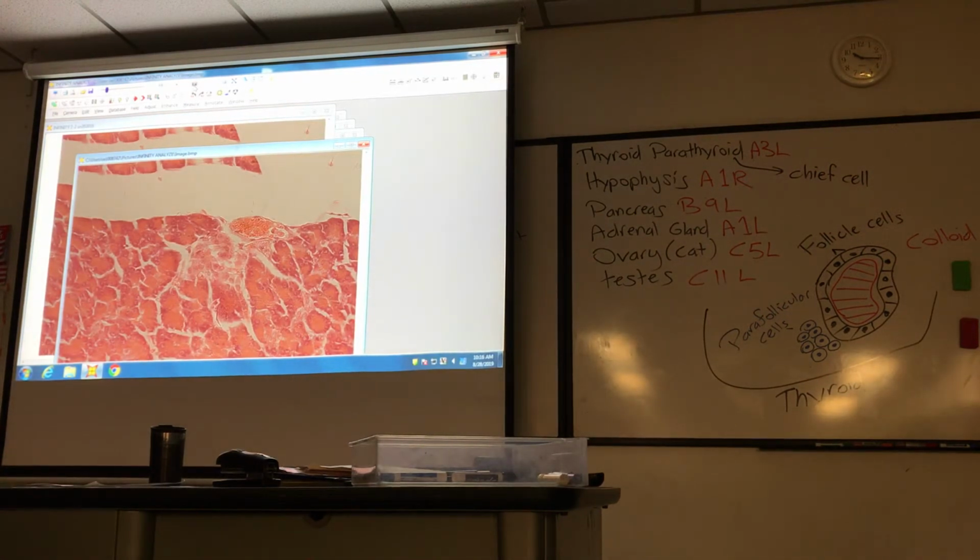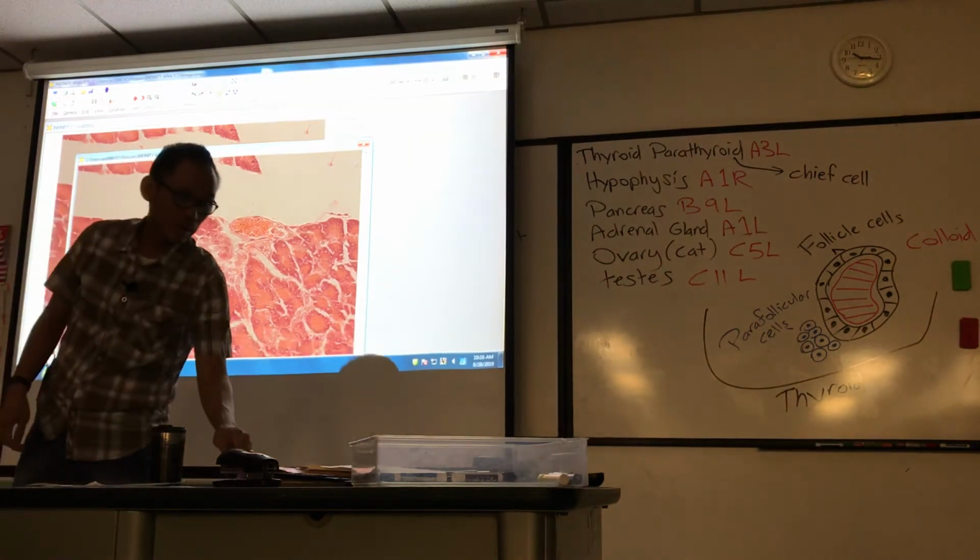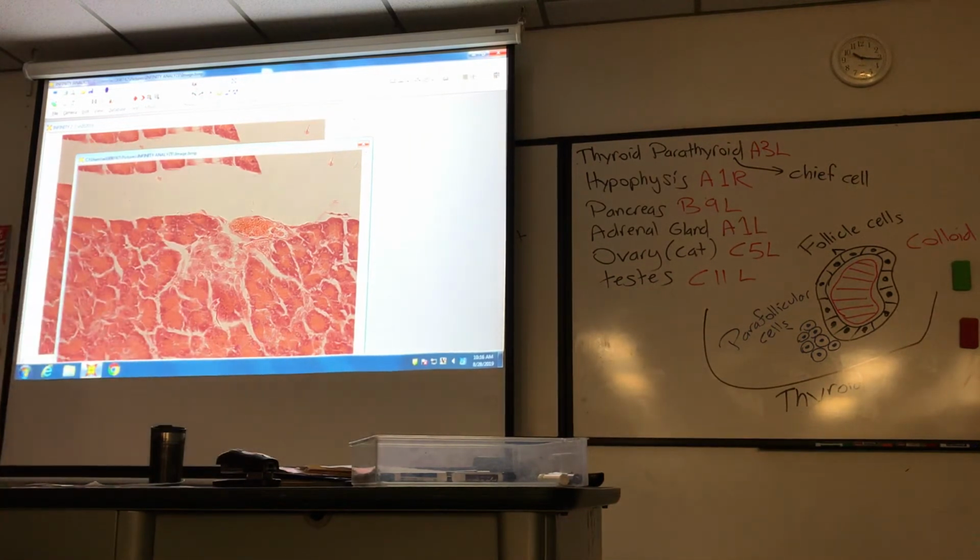So the key for you to understand is what's the islet, what's the blood vessel. I recognize the thin vessel wall there, the small blood vessel. Those are the red blood cells. This is what we're identifying. See the little nuclei there, in this little light staining clump of cells? That's the pancreatic islet. They secrete insulin and glucagon, and we'll move on. It's pretty straightforward. Okay, adrenal gland.